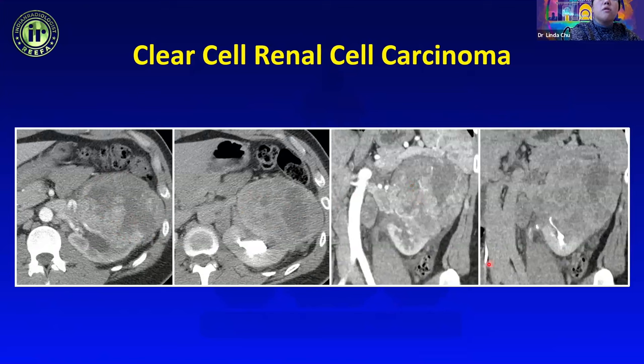Another example of a small classic angiomyolipoma — with smaller AMLs it is easier to identify the fat component on non-contrast imaging, because on post-contrast the entire lesion enhances and it becomes harder to pick out small fat components. With fat-poor AML, there is no evidence of fat on unenhanced CT, so they appear as hyperattenuating or isoattenuating masses relative to renal parenchyma — very difficult to diagnose preoperatively.